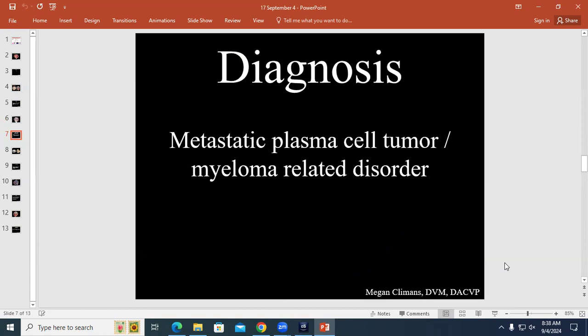There are other patterns that we could use for metastatic disease, for example, multifocal vascular distribution. Especially in the back of the eye where we have the choroid capillaries rather than the RPE cells, you can have multifocal or more diffuse choroid capillaries infiltration, plus or minus the carpeting of ocular surfaces. The adhesion molecule distribution within the globe is really poorly characterized.